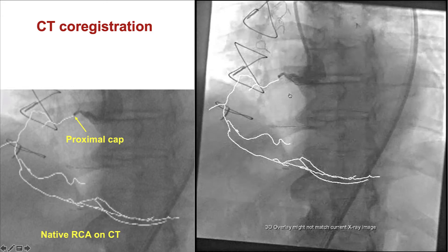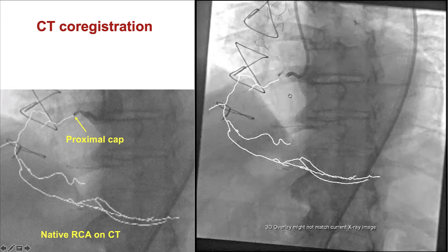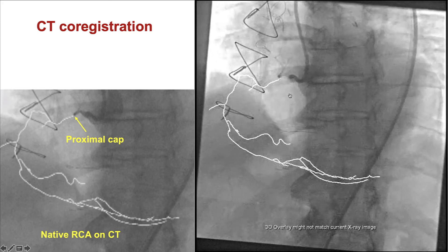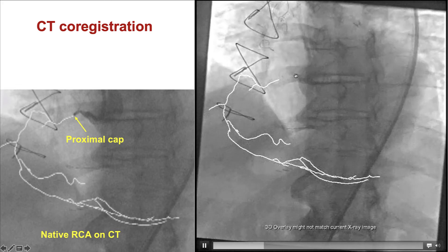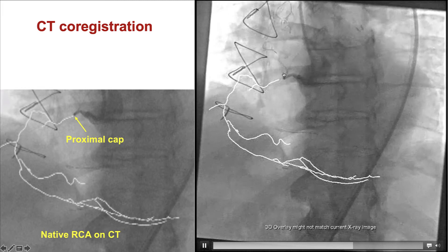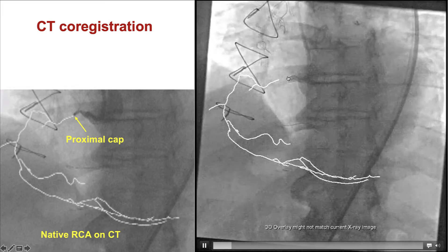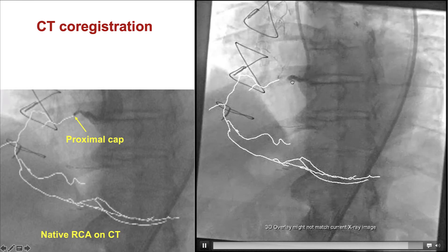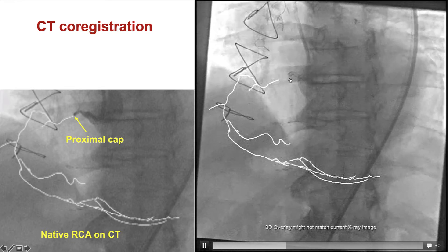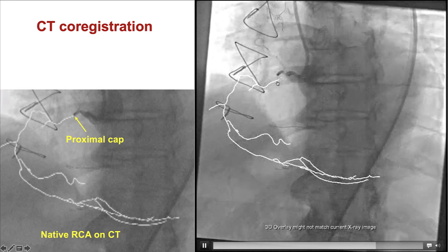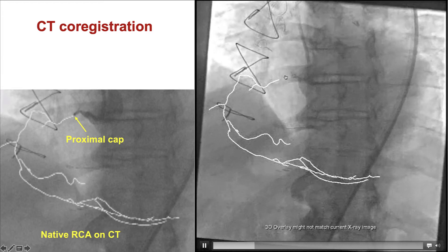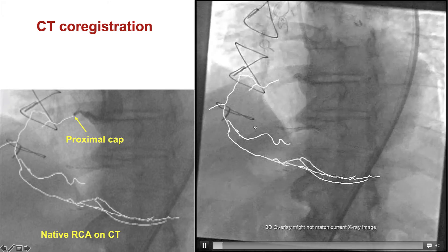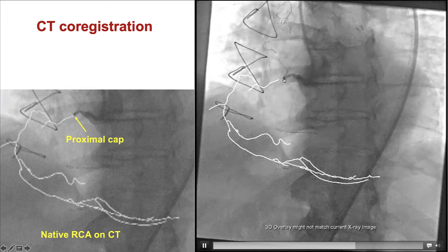This was one case in which we performed CT angiography beforehand. CT angiography can be extremely useful to clarify proximal cap ambiguity. We can see here that there is a small branch at the proximal cap, making it very difficult to understand where the vessel originates. Co-registration — an extra tool that fuses CT images with the angiogram — also allows an estimate of the course of the vessel, and we can see there is significant tortuosity.